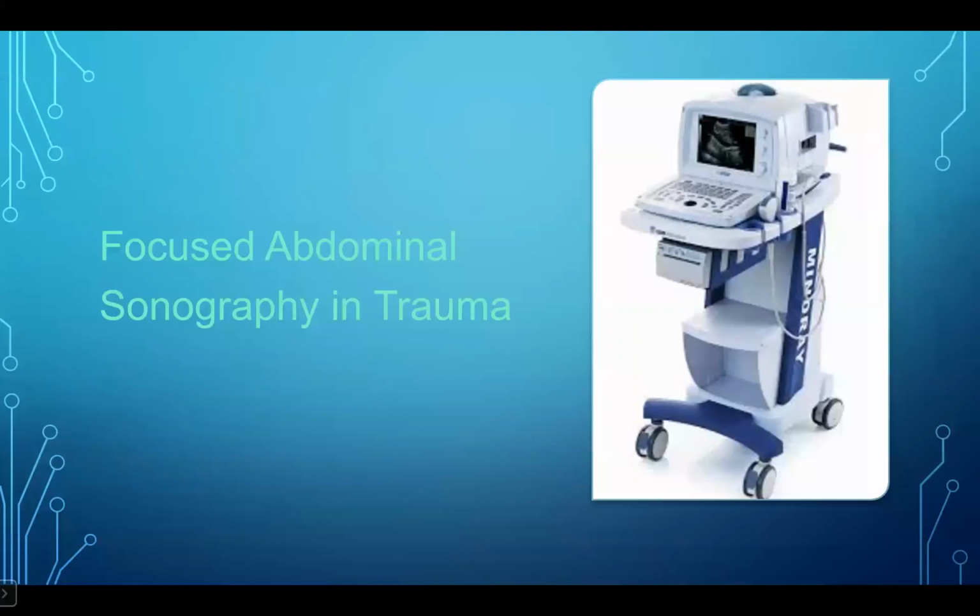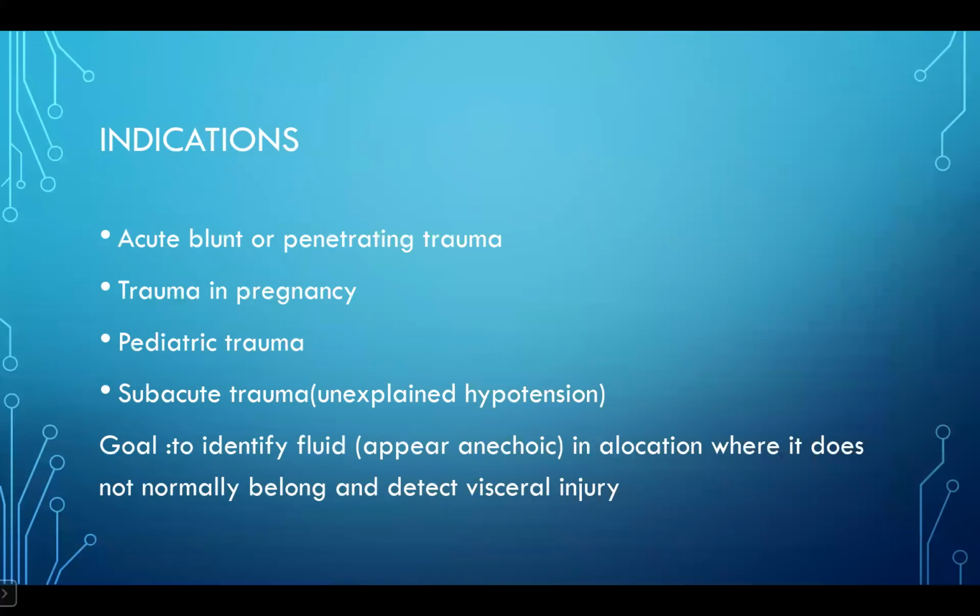Sonography in trauma. The indications are acute blunt or penetrating trauma, trauma in pregnancy, pediatric trauma, and subacute trauma with unexplained hypotension. The goal is to identify free fluid, which appears anechoic in a location where it doesn't normally belong, and to detect visceral injury.